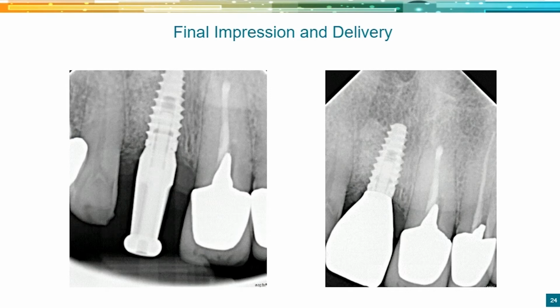So I think that 10-minute guided surgery, you don't have to be doing the same day, but it also makes you a better surgeon because it forces you to choose where this is going, and you have to know why, right? You have to understand the biology at play, the restorative aspect at play. All of this is really, really important and makes you a better surgeon overall.